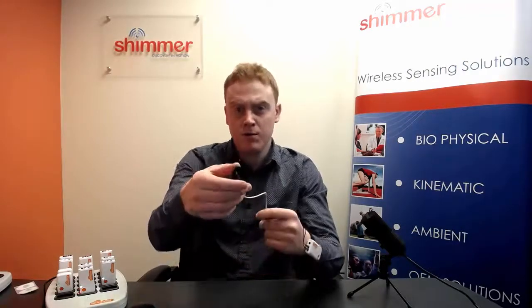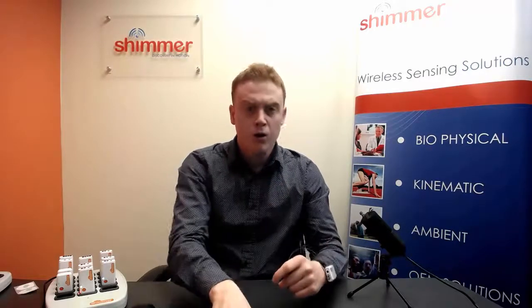The GSR Plus unit can also be used to measure PPG or optical pulse. We provide the user with two choices for measuring PPG. Firstly, from the finger with our optical pulse sensing probe. Or also, from the ear with the Shimmer ear clip.